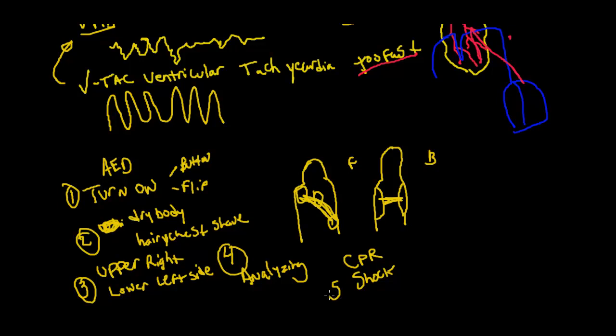And then we're going to shock the body. So when it says shock advised, you say shocking, stand clear. It may take 2, 3, 4, 5 shocks. You just keep going until the AED tells you to begin CPR. So it's never going to completely stop. It's either going to prompt you for CPR or tell you to shock again, or to recheck for signs of life.